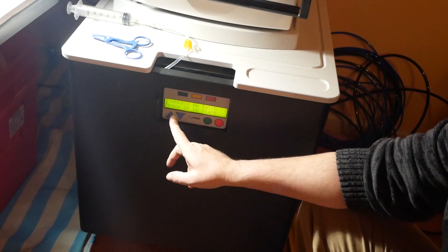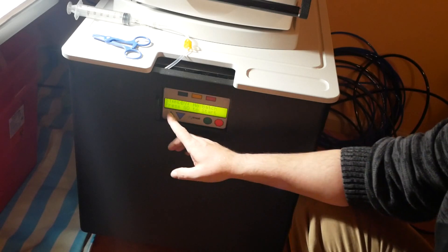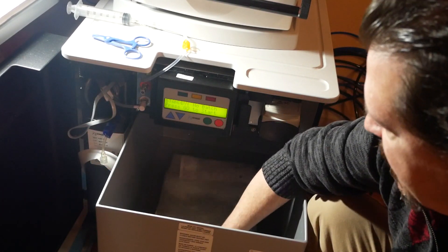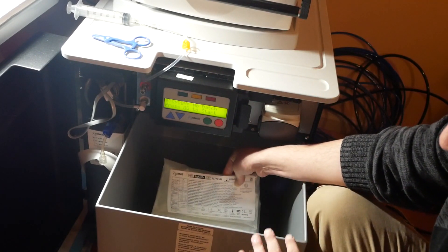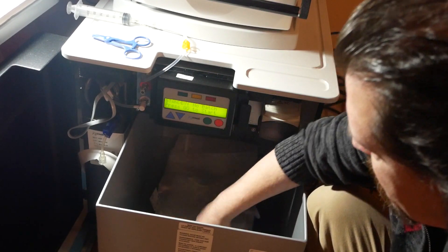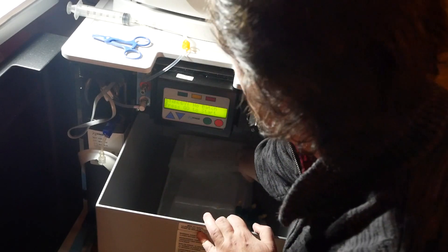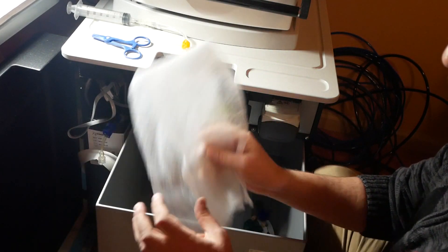We've had the machine turned off, just plugged it back up, and when we do that it says 'standby, no batch, press go to start.' I've already taken my sack and put it down in here. Notice the label is readable - the words are facing the right way - and that part is pushed all the way to the back. Then I unfold it and you'll find this inside - you can just remove that.